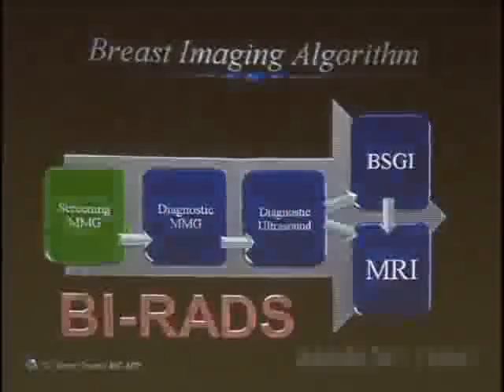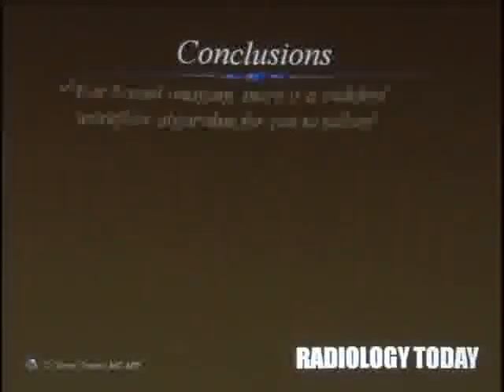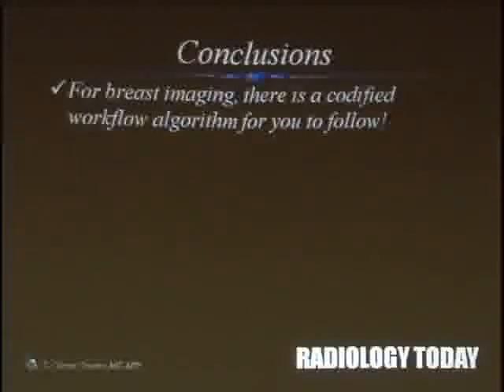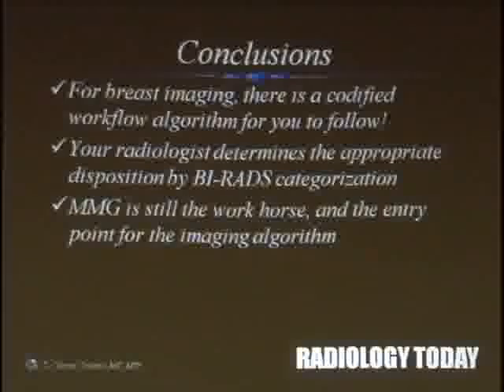Okay? So, concluding statements. We're almost done. Here we go. Big, broad brushstrokes review. For breast imaging, there is a codified workflow algorithm that you can follow. It's not like other imaging. There's no guesswork. Your radiologist determines the appropriate disposition of your patient by that number, which is unambiguous, or should be if you've got the right radiologist.